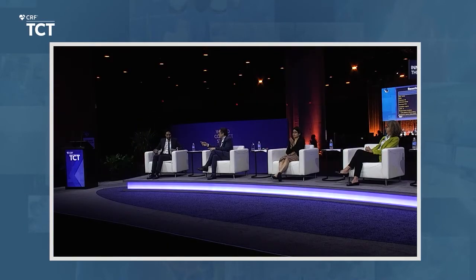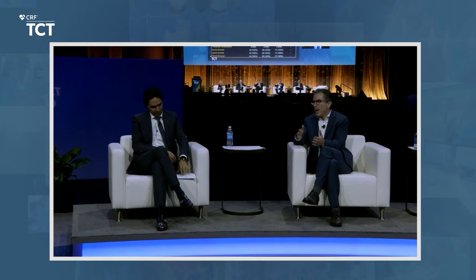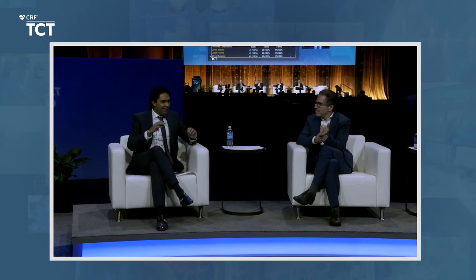I have one question for you before Akiko goes. So how should I apply these findings to my practice? So I do an angiogram, highly calcified lesion. What do I do? I think the first and most important thing to remember is the angiogram is still the gatekeeper, right?